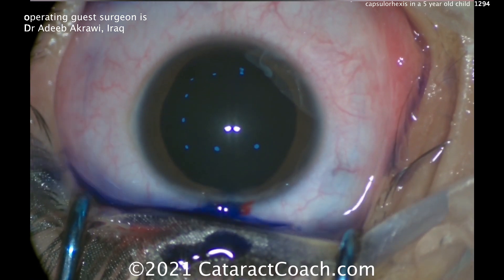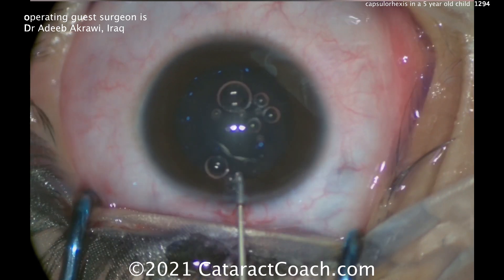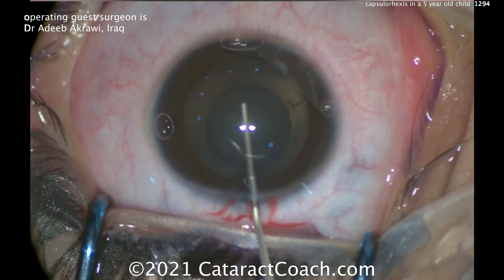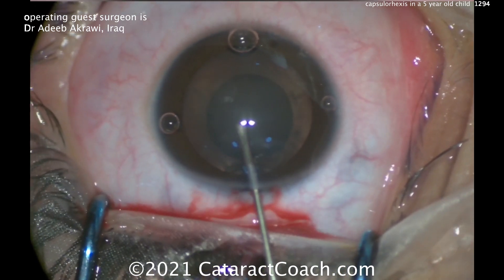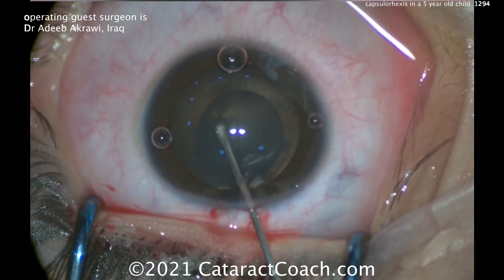Trypan blue dye is very important because it not only gives you better visualization, it actually decreases capsule elasticity. So it's really important in this 5-year-old child. Remember, when you're operating on a young person like this, you've got to remember this surgery is going to last this patient 70, 80, 90 years.